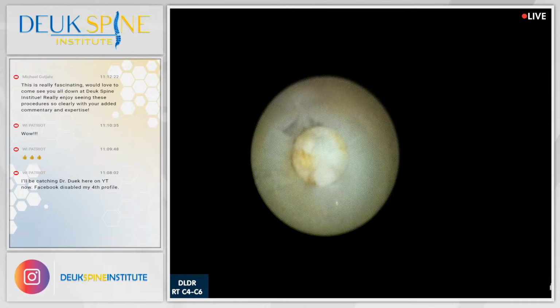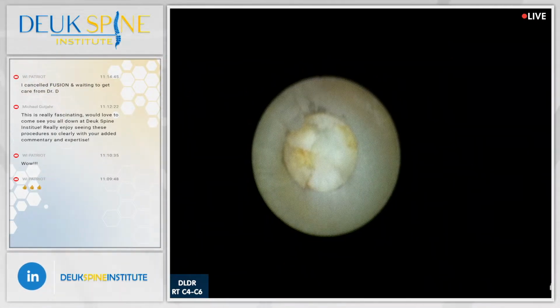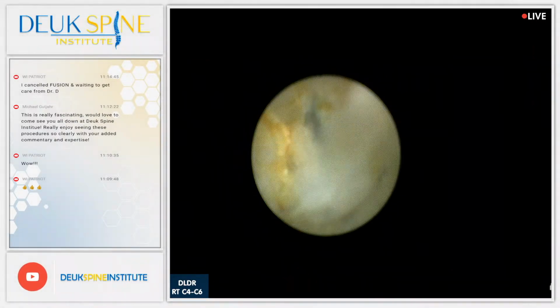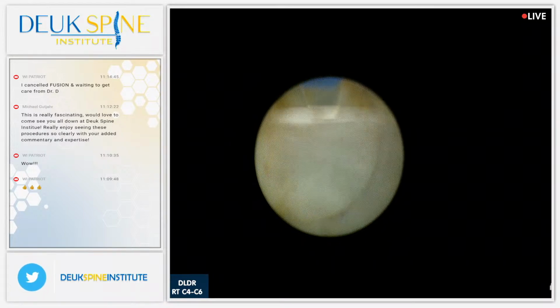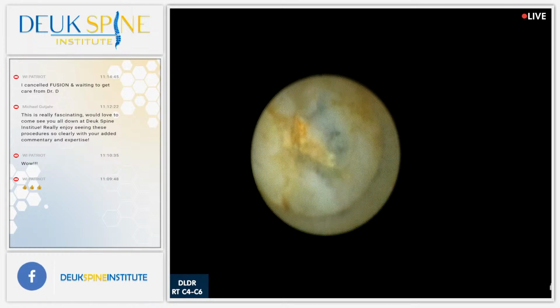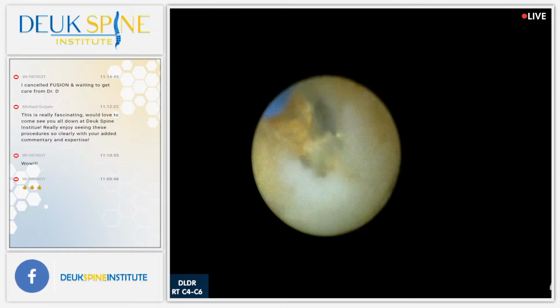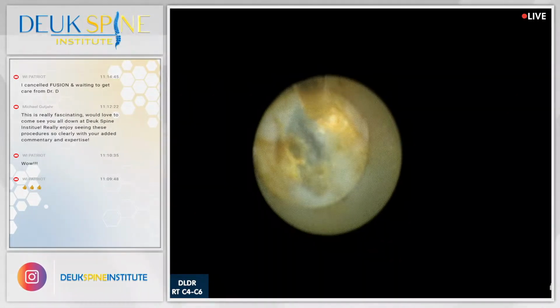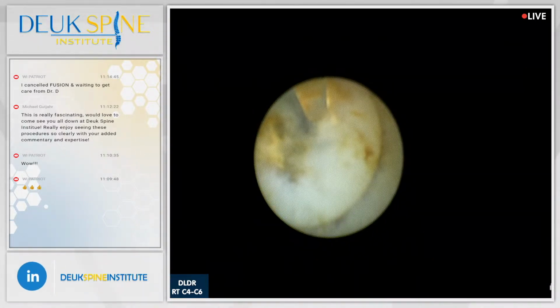All right. So I'll be happy to take a few more questions. I need 4 more minutes. This next question is coming from Brad, once more on YouTube. Hi, Brad. He's asking, what are your thoughts on discograms? I don't know what you're asking, Brad. We do discograms. I know you know that. Are you asking about discograms before surgery, like as a diagnostic test? If that's the question, I'm a big believer in discograms, but I don't do them before surgery.